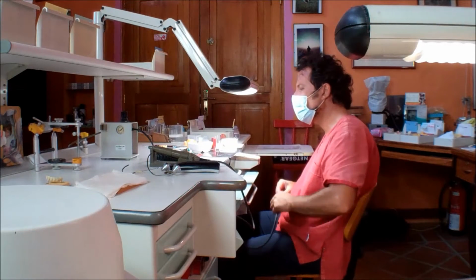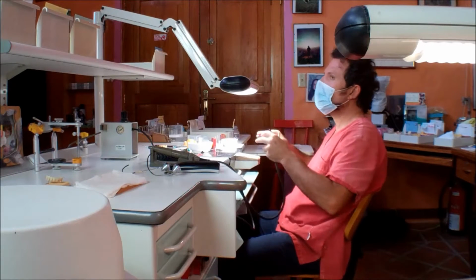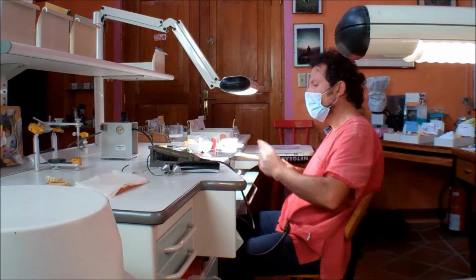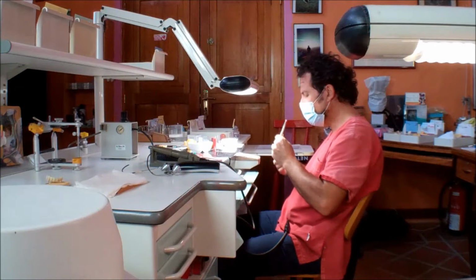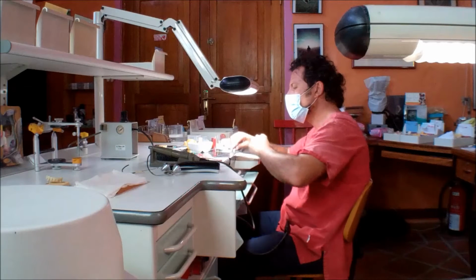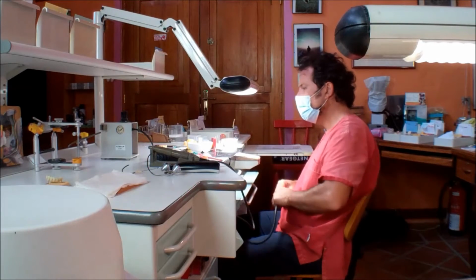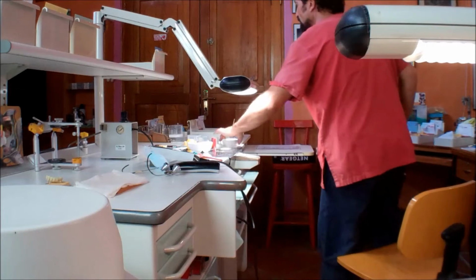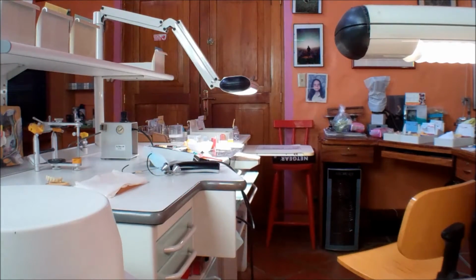Yeah, this always happens when you have the structure of the crown or bridge in zirconia, and then you cover 100% with porcelain. In our case, it's different. Our case is 100% zirconia in the function. After the function, we put porcelain. Nice. So I don't need to worry then about delamination? No. It doesn't exist here. There is no point that exists. Nice. I'll show you.